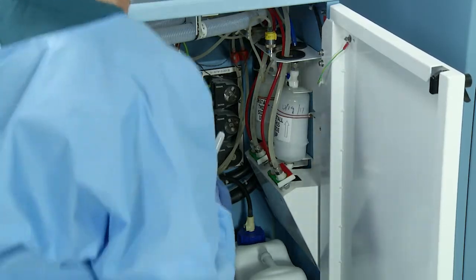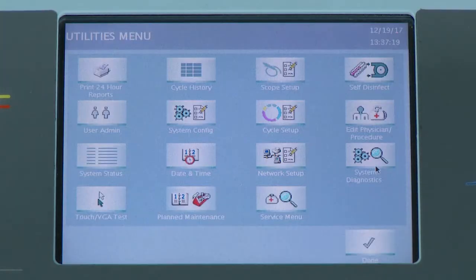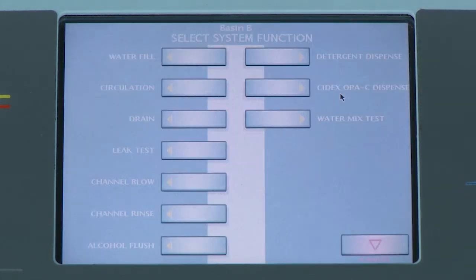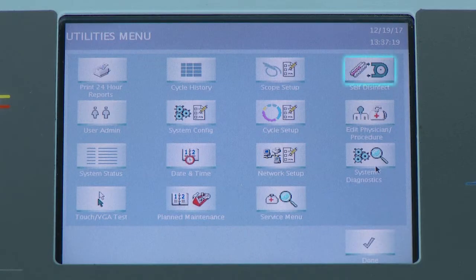Now plug in the system and turn it on. Next, perform a manual water fill using the diagnostic menu, while observing the water flow in the filter to make sure there is no air gap. If an air gap is seen, it can be removed by loosening the front connector. Finally, proceed to self-disinfect cycle.